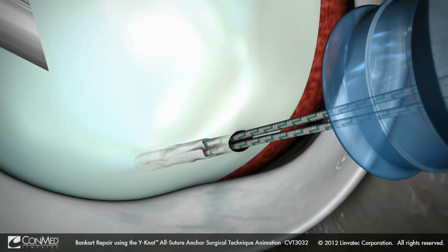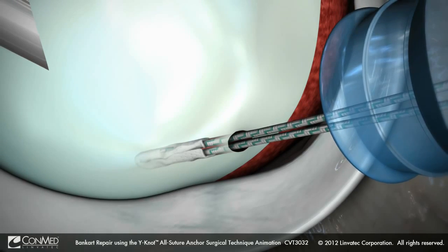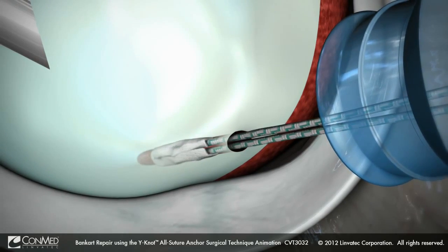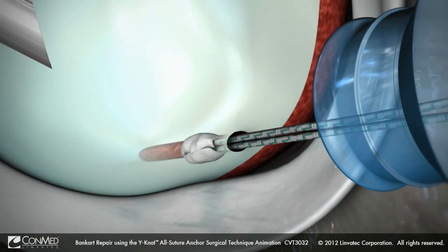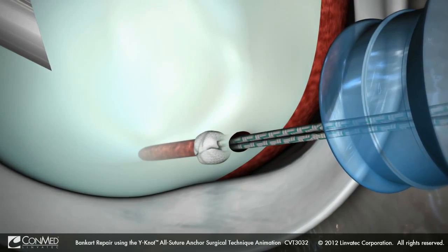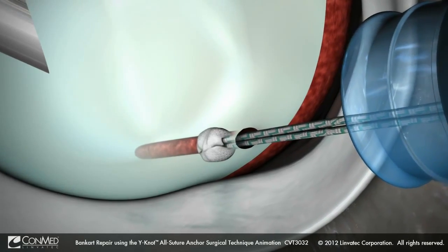Pull on both suture limbs to set the anchor. The soft anchor will compress, expand laterally, and form a 360-degree fit within the pilot hole.